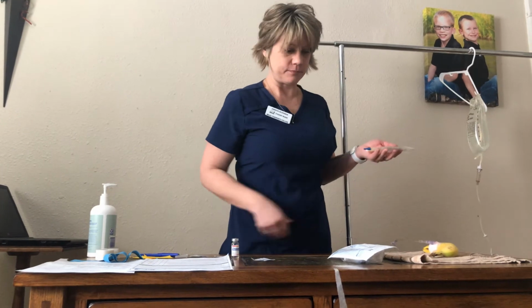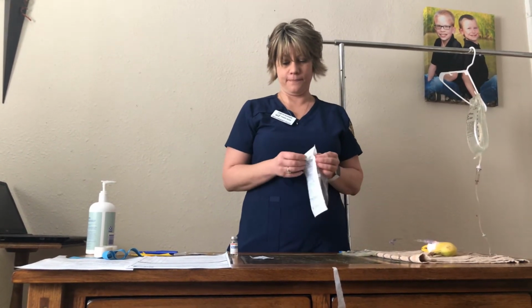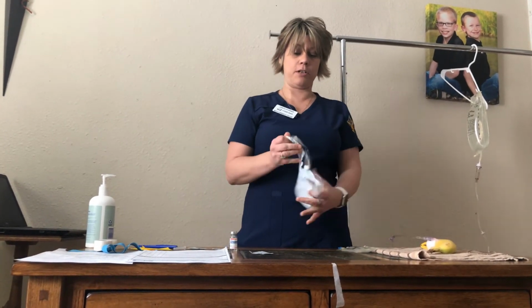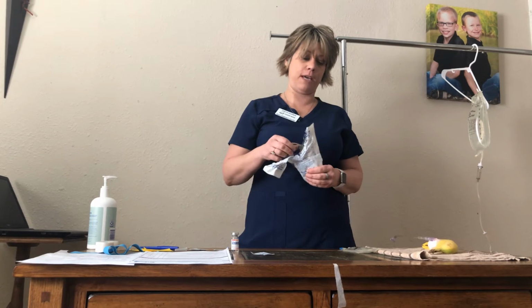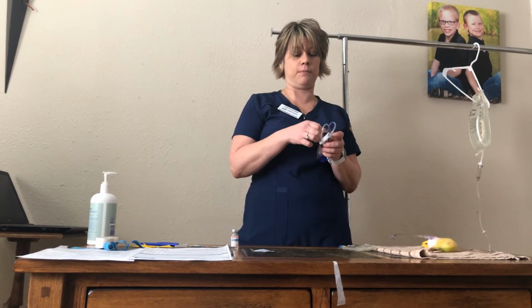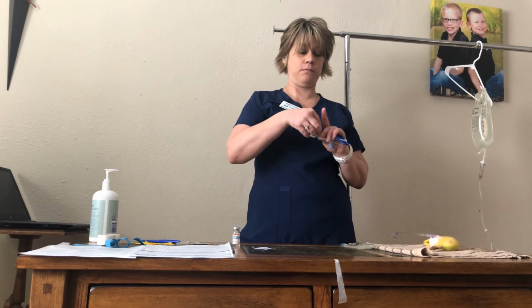And then I'm going to need to get my tubing attached and ready. I'm going to make sure to hang my IV piggyback higher than my saline that I started with, my regular infusion.